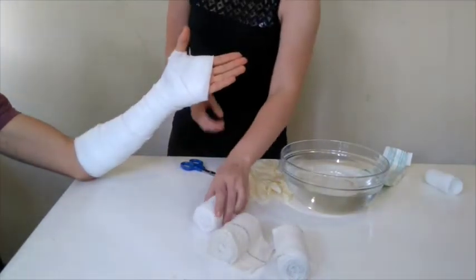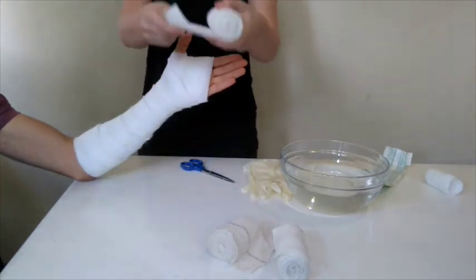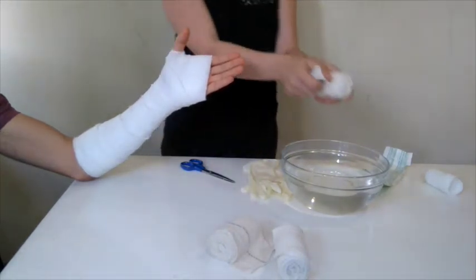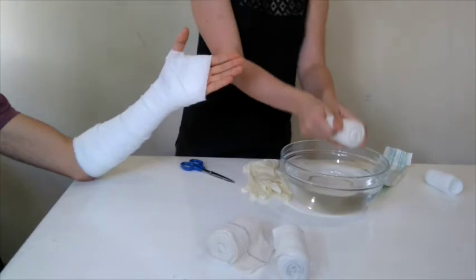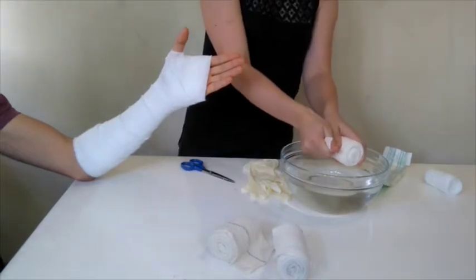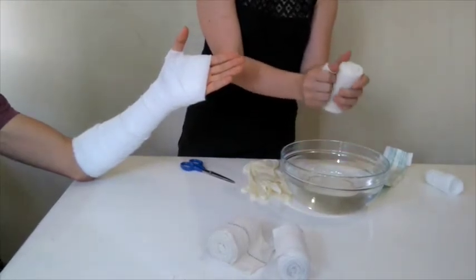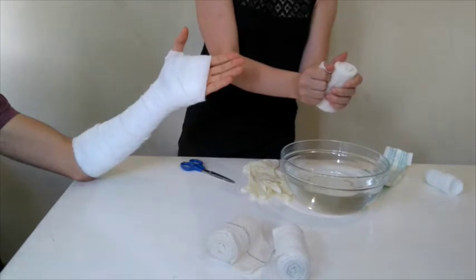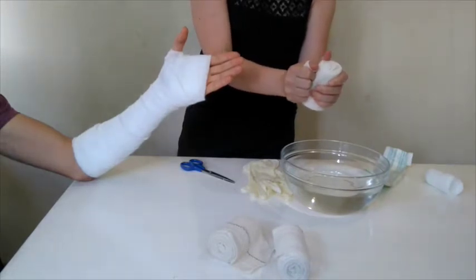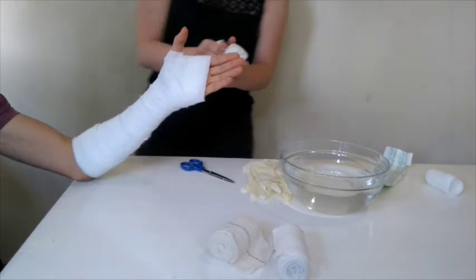You should put on gloves before working with the plaster of Paris. For the purposes of this video, we'll only be using normal bandages and so gloves were not put on. Holding the plaster roll in one hand and the free end of the plaster in the other, submerge it in the water until all the bubbles disappear. Then remove it and squeeze gently to get rid of excess water.